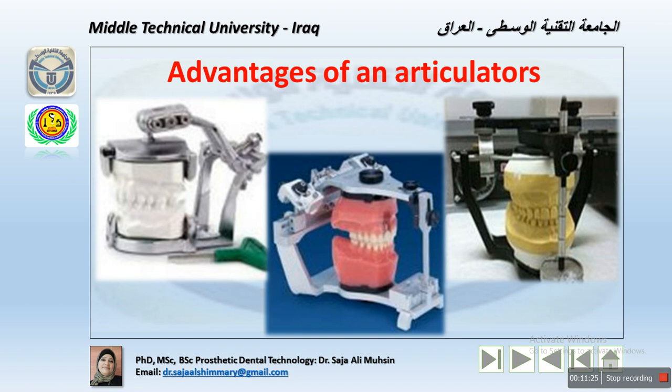Of course, from the viewing and diagnosis point of view, for the practitioner or the dentist, there is a limited view within the oral cavity, which this can easily give a proper visualization of patient occlusion using the articulator with the lingual view on it.